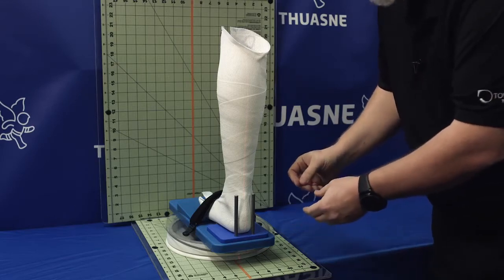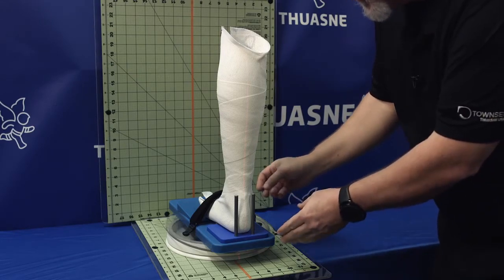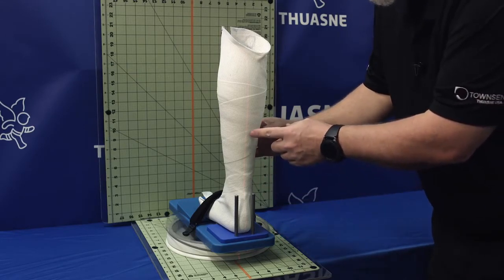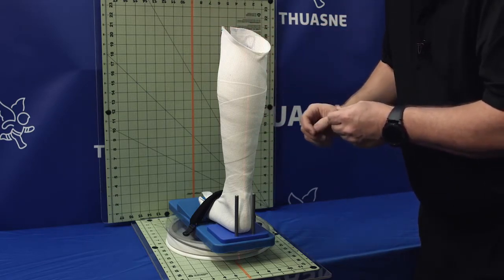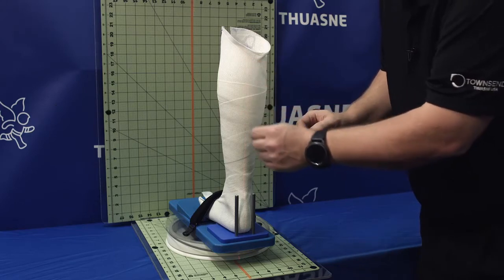We're going to give you examples of proper alignment with this shot. You can tell that we have an alignment line which will closely mimic the alignment grid that's in the back. So this is going to be center tibia.